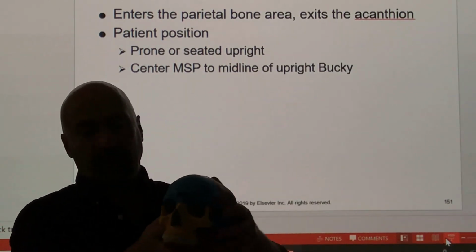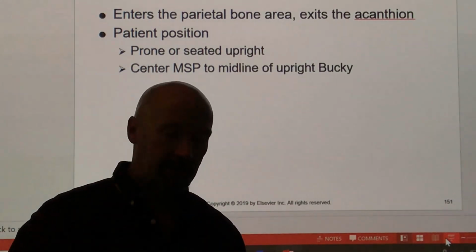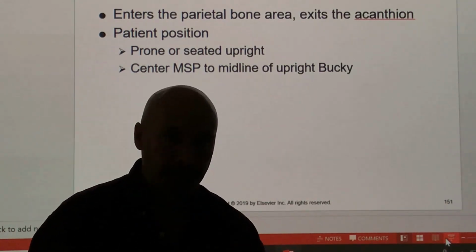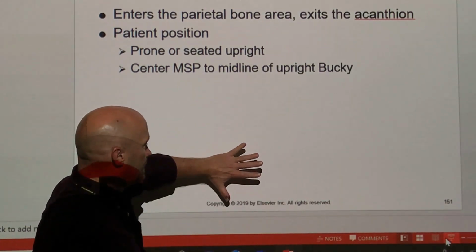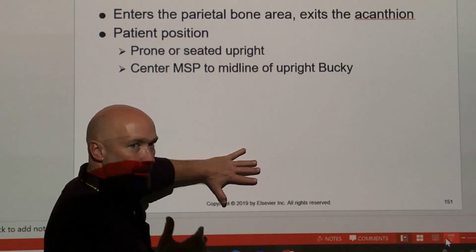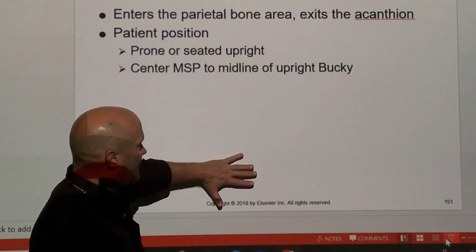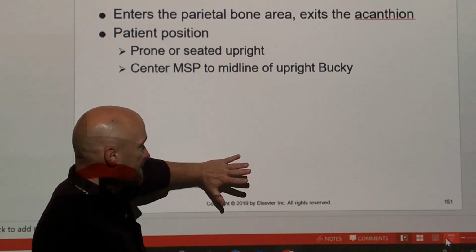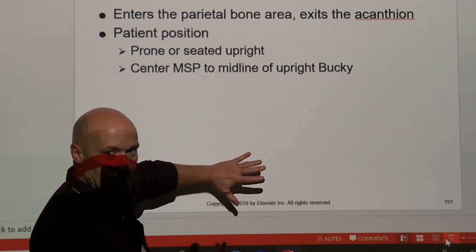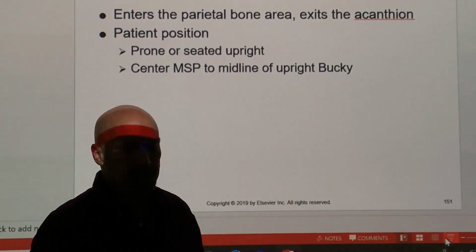The other thing is kind of like when we were talking about our hands. If you wanted to see joint spaces, you had to have the joint space perpendicular to the image receptor and parallel to the central ray. If you fail in one of those two ways, you'll close up the joint space.